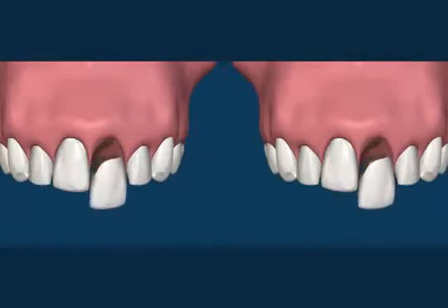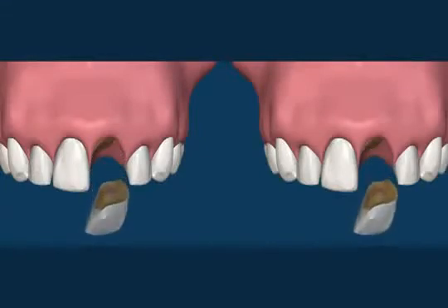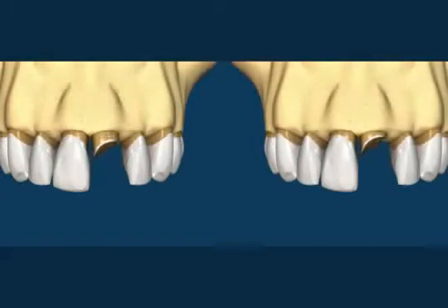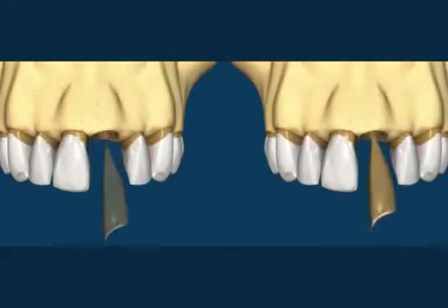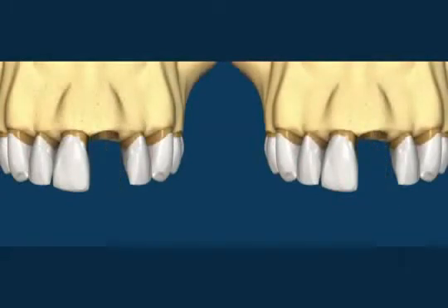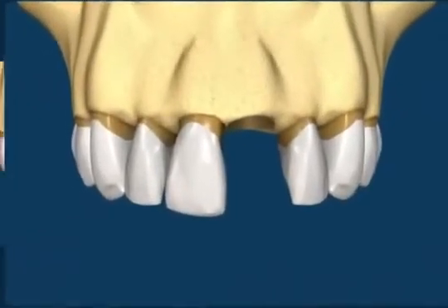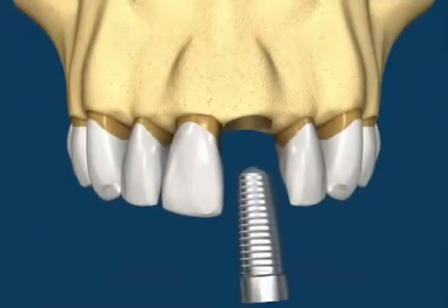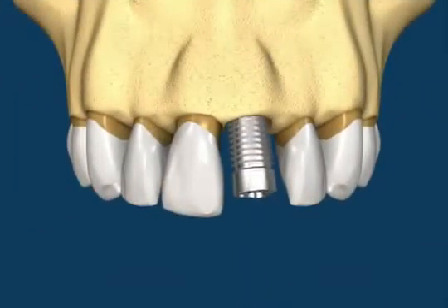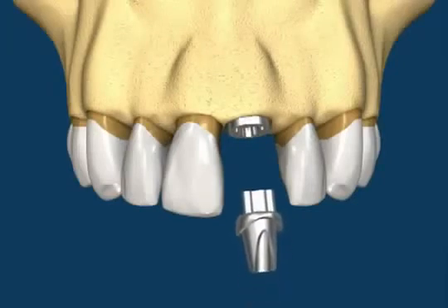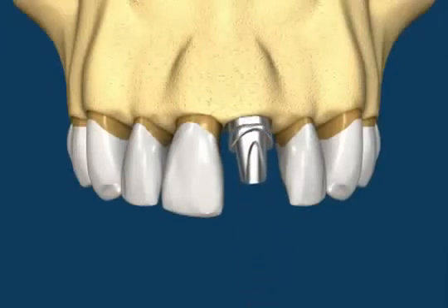This animation shows two identical situations being treated in two different ways: the loss of the central incisor. The animation on the right shows the implant option — here we have an immediate implant placement, followed by the post and core which is secured to the implant fixture, followed by a crown.